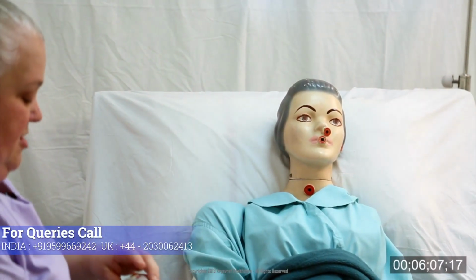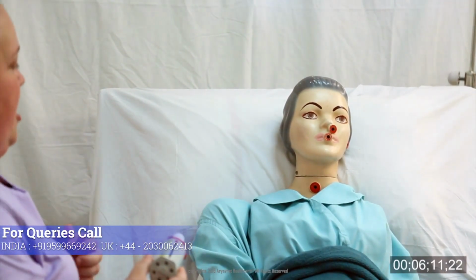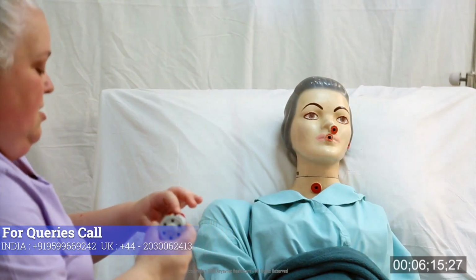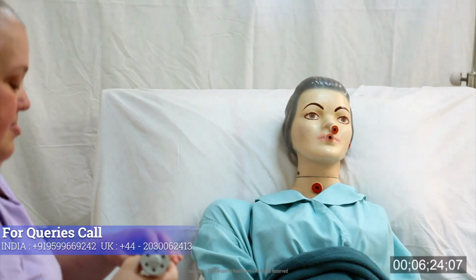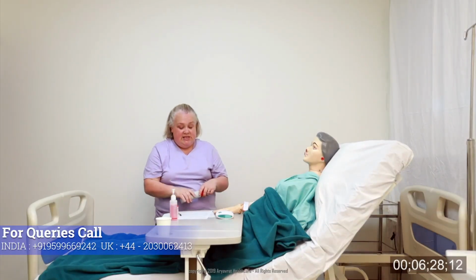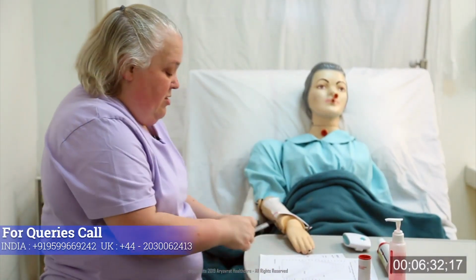Okay, so we got 250 there, Helen, on your first one. Well done. That was a good short, sharp puff. One more. Again, 260. And one last final one. Okay, 240. So 260 is your highest reading there, Helen. So I'm going to plot that on here.